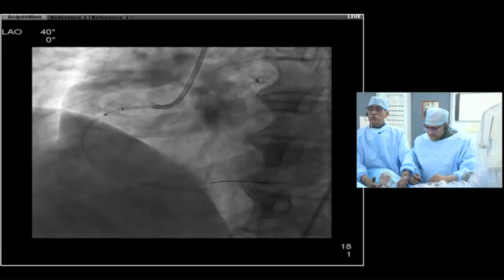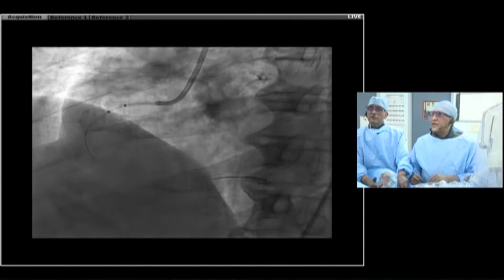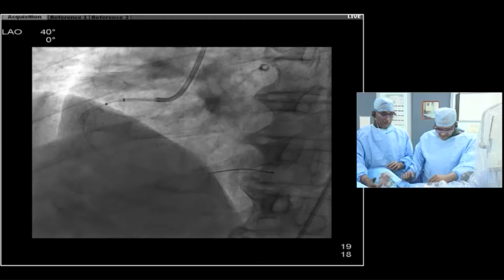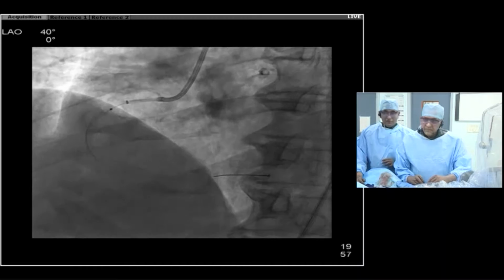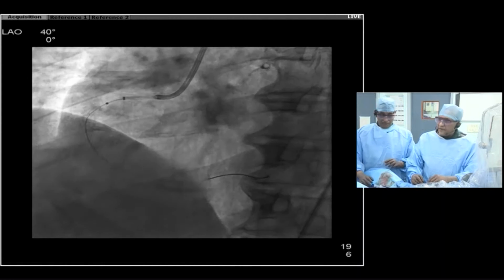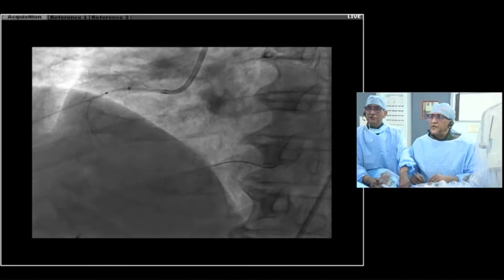I was just going to say, typically this use of the laser is great for uncrossable lesions. If the balloon doesn't cross, then you would do this. Kirti mentioned he's doing it to demonstrate the laser technique. Remember, with laser in a de novo lesion, you have to do it safely. So he cleared the contrast, because otherwise you'll get a massive explosion there. Now show how you do it. You'll basically do a nice saline flush, nice and smooth, to clear the contrast forward. And this is the 0.9 laser, right, Kirti? It looks bigger than 0.9. Is it 0.9?